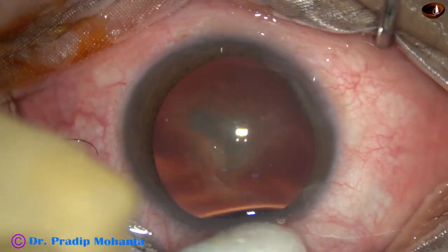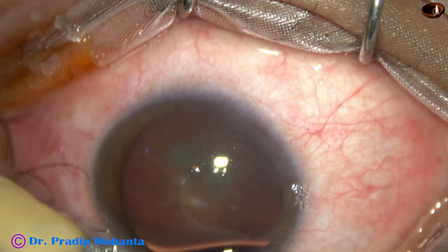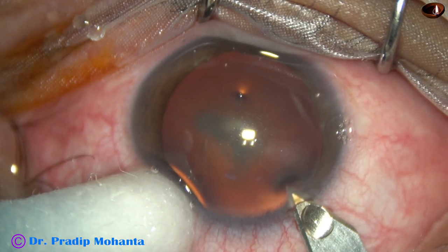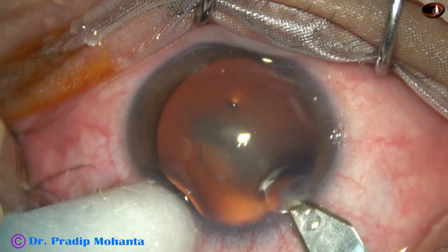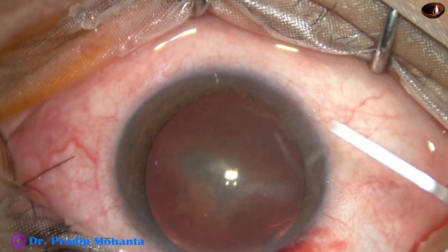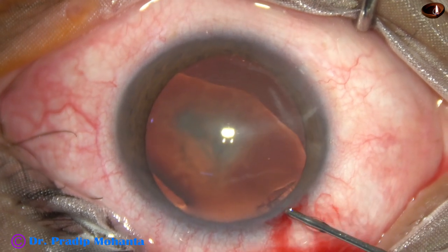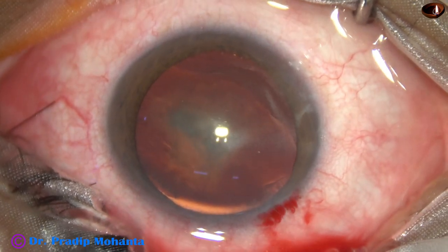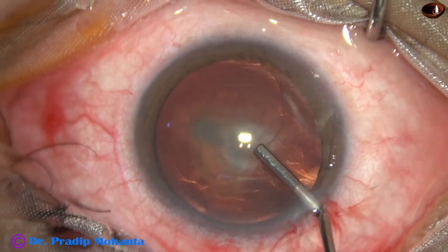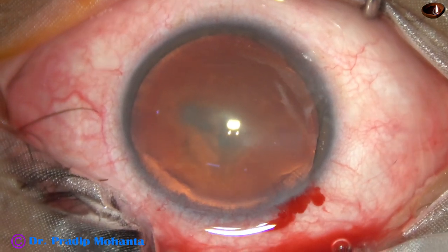After thorough irrigation of the ocular surface with BSS, this is the main incision on the posterior aspect of the limbus with a 2.8 millimeter steel keratome. And now this is phenocaine, which contains phenylephrine, tropicamide, and xylocaine. The anterior chamber is then filled up with 2% hydroxypropyl methyl cellulose.